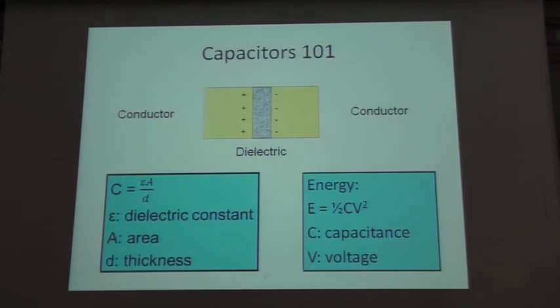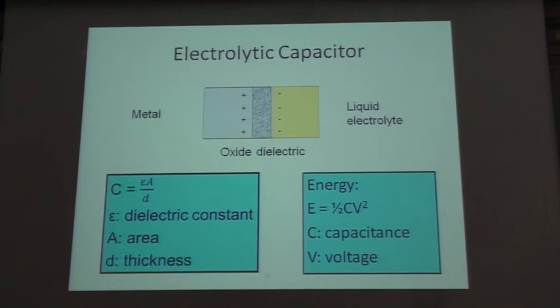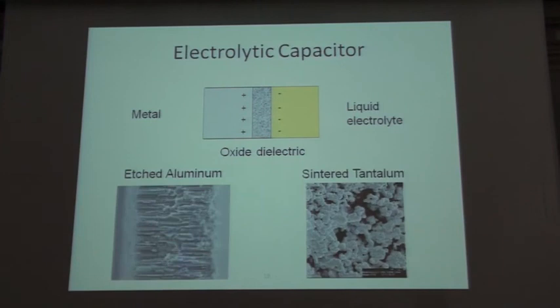So that's basically a capacitor where one side is a metal. The dielectric is the oxide of that metal. You grow directly on the substrate. And then you use a liquid electrolyte on the other side. Using that liquid allows you to fully access the surface area of a highly porous object that you could use. Basically, the two things that end up being useful are aluminum can be etched, and you can get a highly porous substrate. You can grow oxide to operate about 400 volts. You can have two capacitors in series.